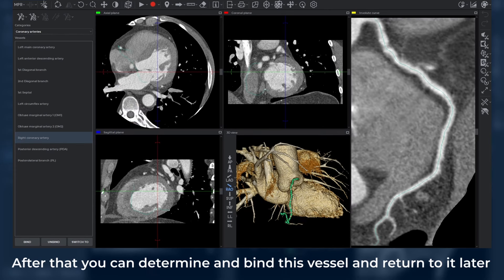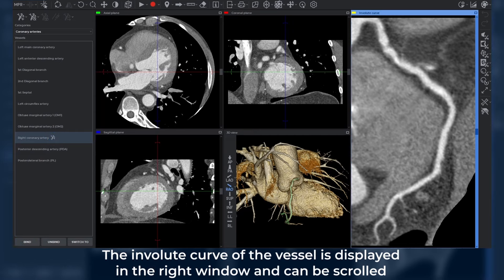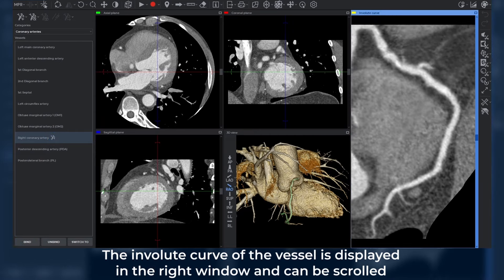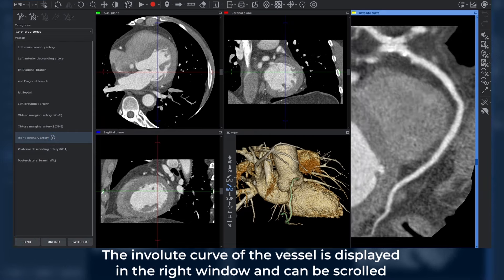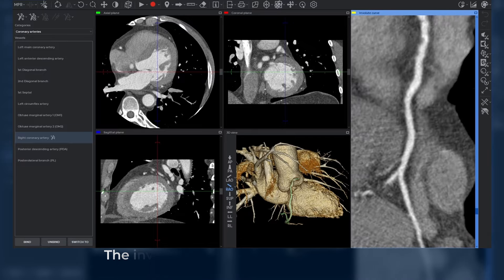After that, you can determine and bind this vessel and return to it later. The involute curve of the vessel is displayed in the right window and can be scrolled.